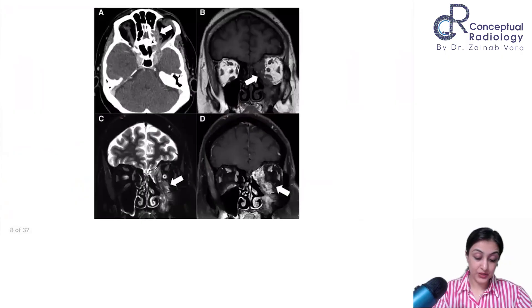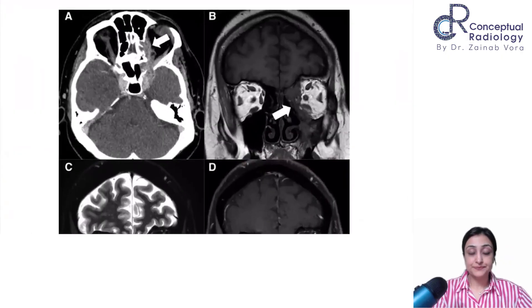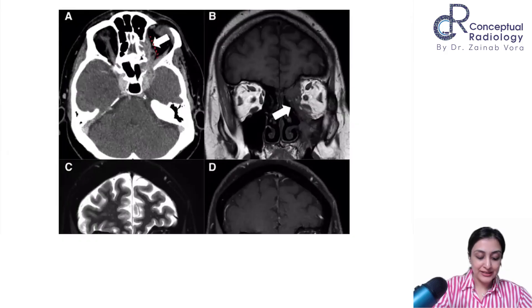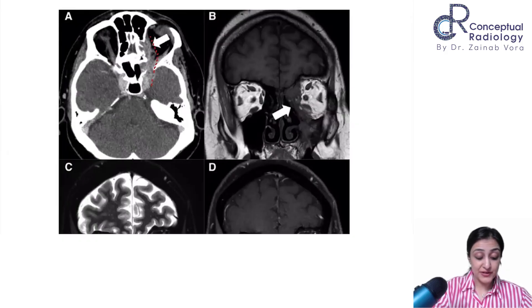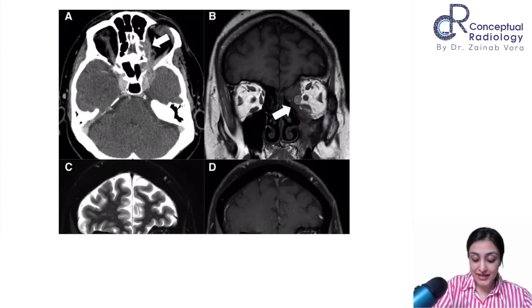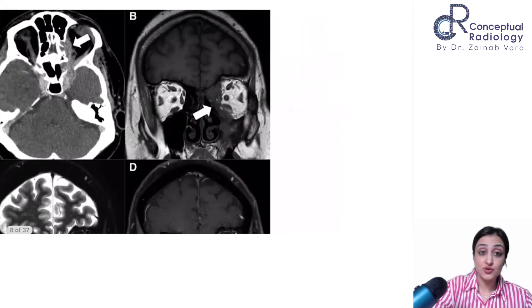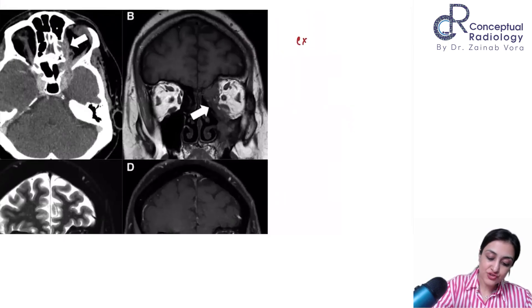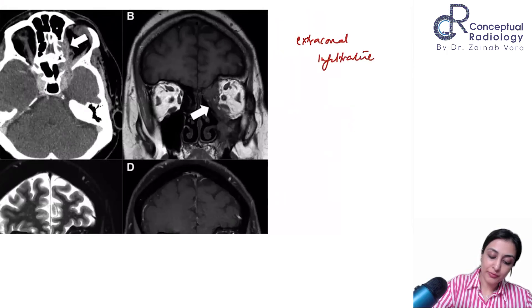Next case: the arrow shows a mass involving the orbital apex, presenting as orbital apex syndrome. This is orbital pseudotumor — extraconal infiltrative soft tissue involving the orbital apex and extending into the cavernous sinus.